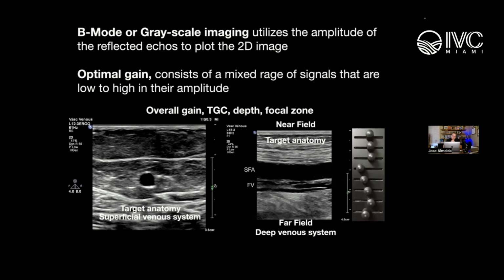Yeah, that's important because we get second opinions come to the office and I want to repeat the ultrasound in my office and the patient says, why? I already did an ultrasound. And my response is, I just don't believe anything going on out there. That's why we like to see it ourselves. This is operator dependent, and that's the part that patients need to understand, that labs have different skills. And of course, there's machine quality issues too, which we won't get into here, but some machines are superior to others.